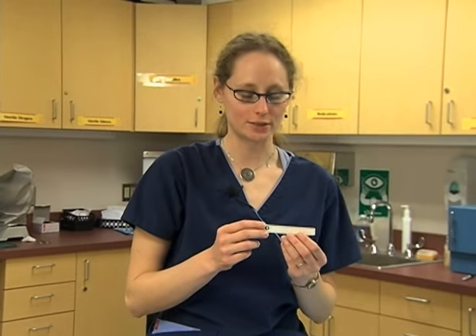The last item in the kit is an indicator. And what it will do is it's going to tell us that the temperature inside of our kit got to the proper temperature that we need for these tools to be sterile. So we want to make sure that we put one inside.